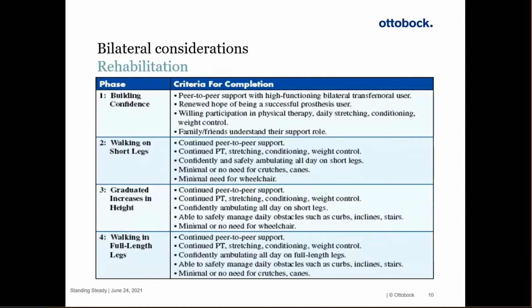Walking on short legs, often referred to as stubbies, is something that is really helpful for generating that initial stability and also working with safe ambulation around the house. Some people may use stubbies permanently. They call them stubbies for life, or almost think of them as like your slippers when you get up and do the things you need to do around your home.